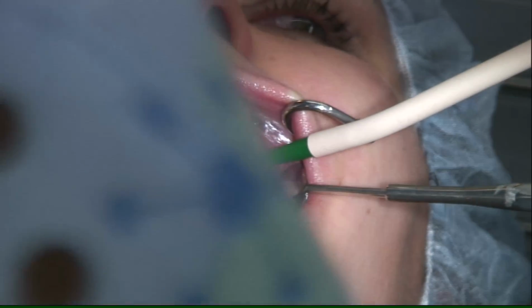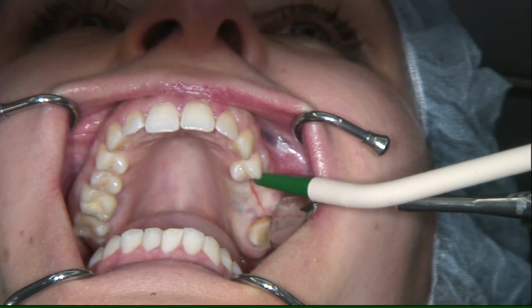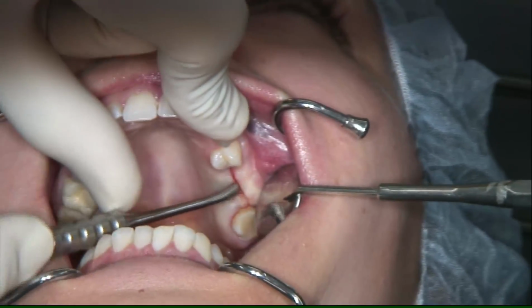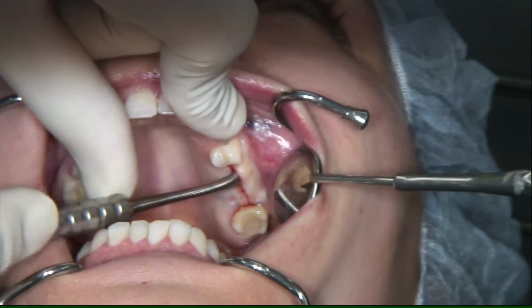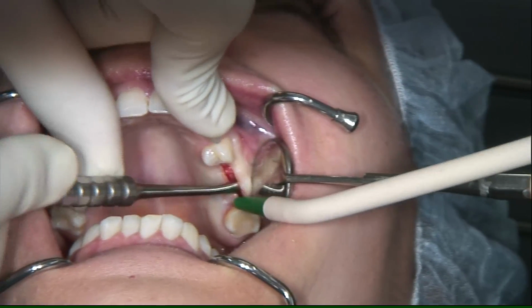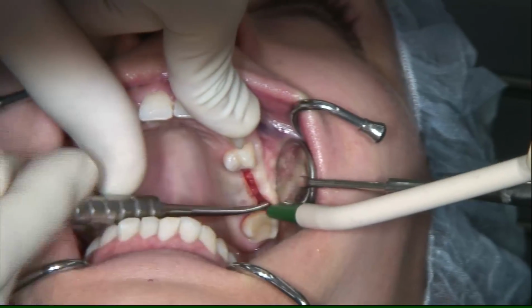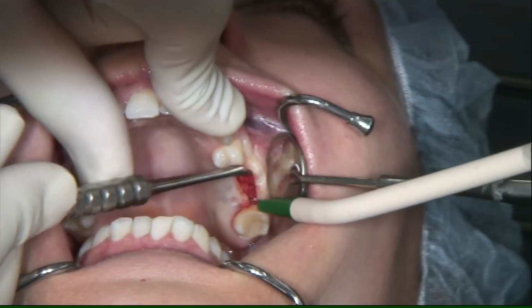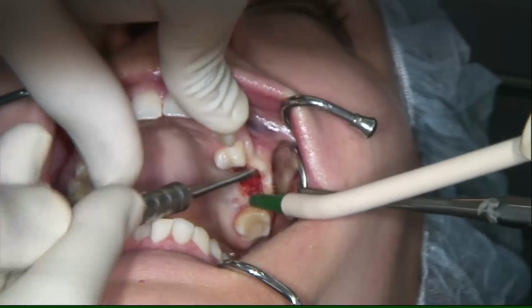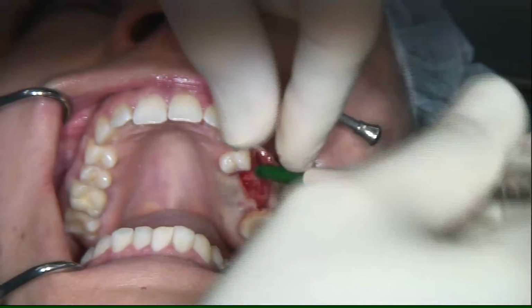So the plan was to do a minimal invasive treatment, and that's why we were planning the case before. Because also when you do socket preservation, which was performed 4 months ago, we don't know if we have some bone loss in that area. Another study from Fickel and Zur 2007 showed that socket preservation with bone substitutes showed slightly better results in comparison to avoiding socket preservation. But anyway, in many cases we can't totally avoid some loss of bone because of loss of the bundle bone.